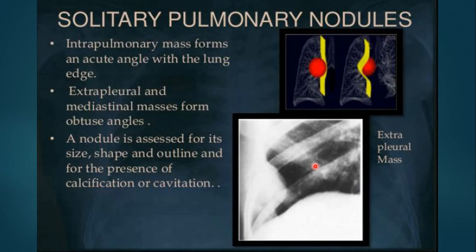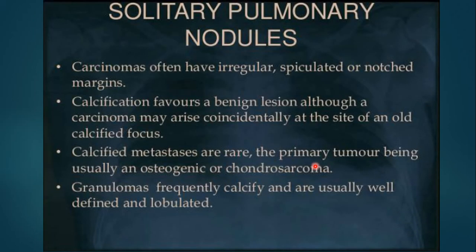When you see a nodule, you should assess the following: the size, the shape, the outline, is there any calcification or cavitation? Every one of these has a different differential diagnosis. Okay.